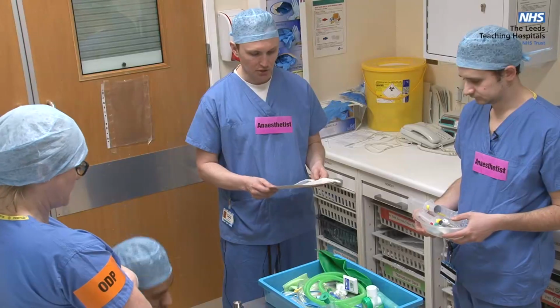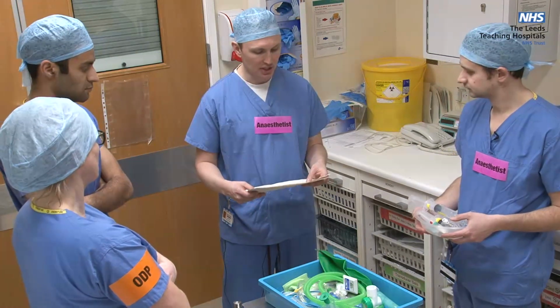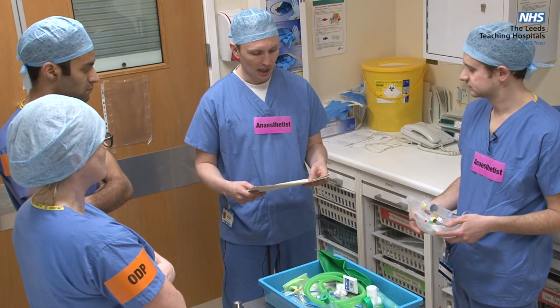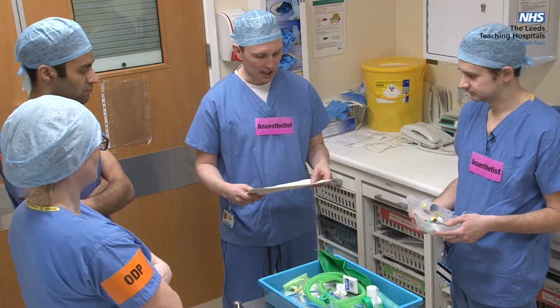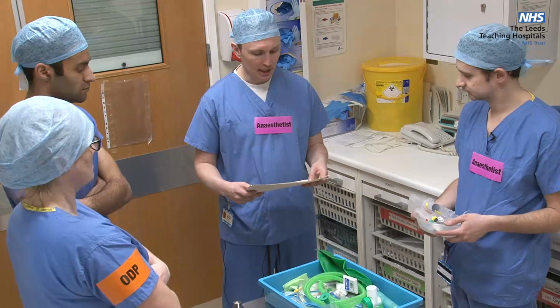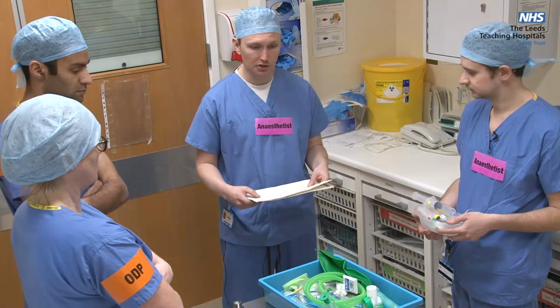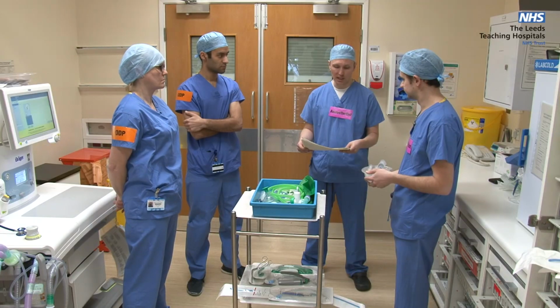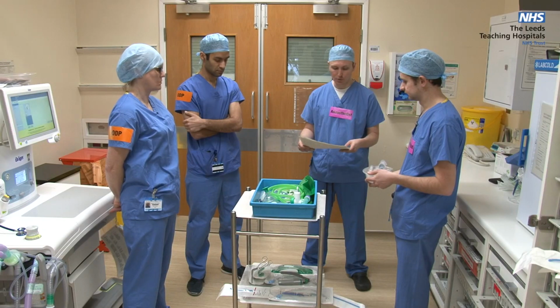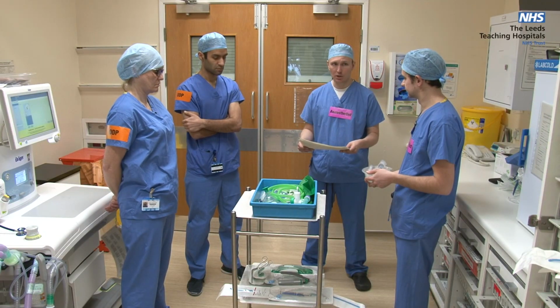Yep. That's great. So to complete the checklist outside, the patient's weight is 70 kilos, and their drug allergy status is. There are no known drug allergies. We've checked the drugs already. In terms of difficult airway procedure, plan A was going to be indirect laryngoscopy with our video laryngoscope. Plan B is going to be using a supraglottic airway, which Harshal will provide us with if we require. And plan C is going to be front of neck access. Has anyone got any questions?